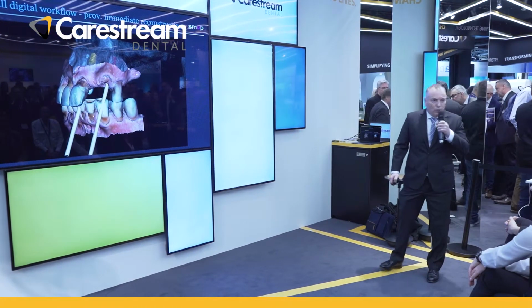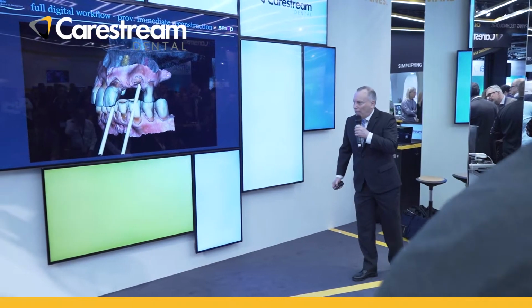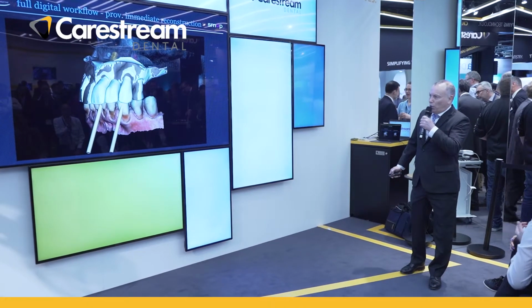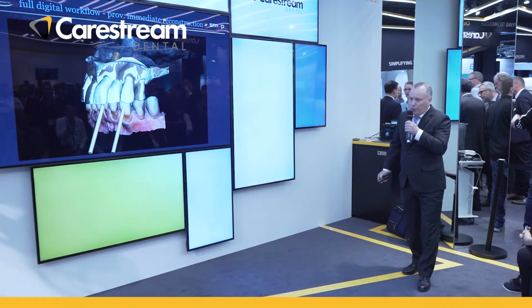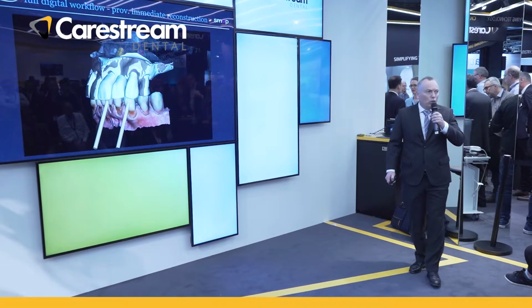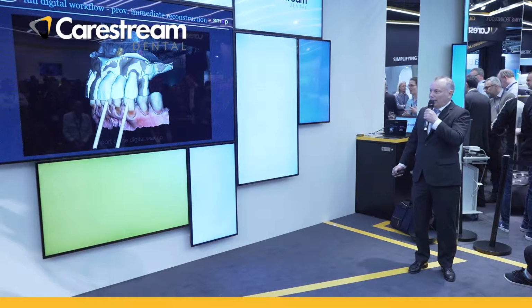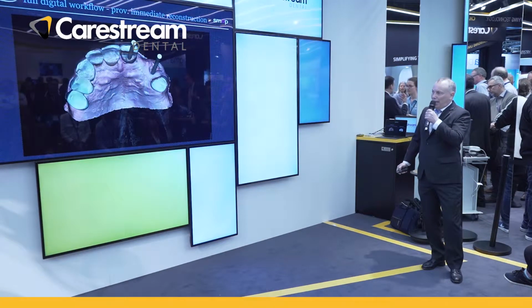The aim of this case was to do a screw-retained bridge. My dental technician did a wax-up in ExoCAD, and I could also import this wax-up into the SMOP software, so that I can really check the position of the implants I planned.